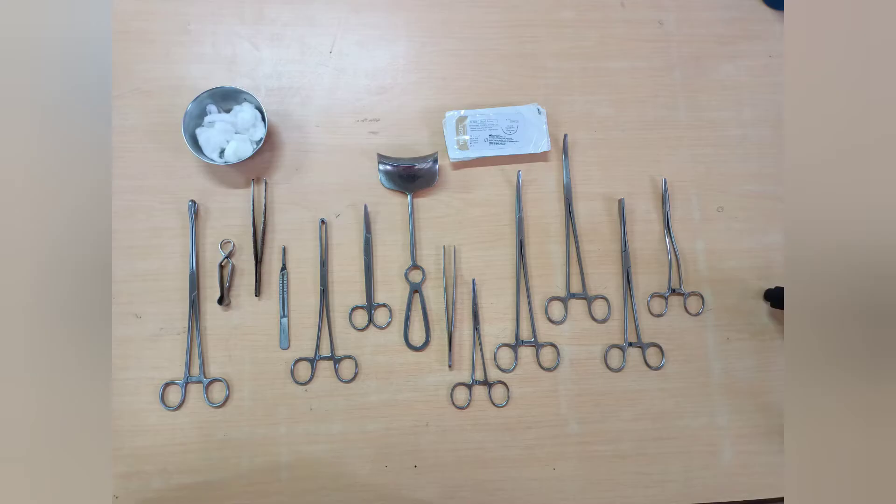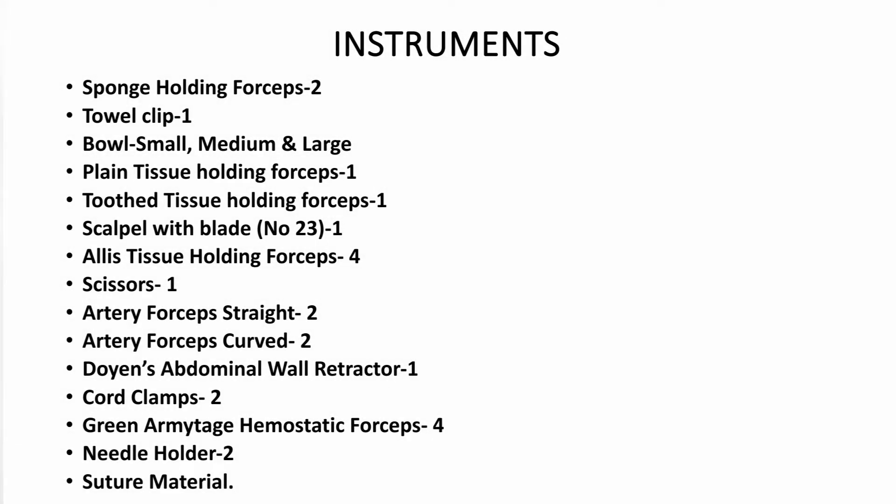The instruments for the caesarean section are: sponge holding forceps, towel clips, bowl, plain and tooth tissue holding forceps, blade with a scalpel, Alice tissue holding forceps, scissors, artery forceps, Doyne's abdominal wall retractor, cord clamps, Green Armitage forceps, needle holder, and some suturing material. This video is going to explain the stepwise requirement of these instruments.